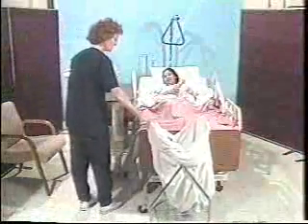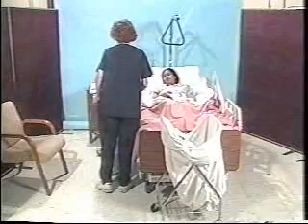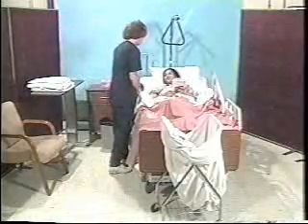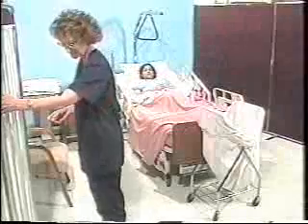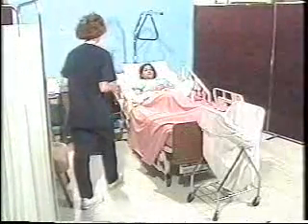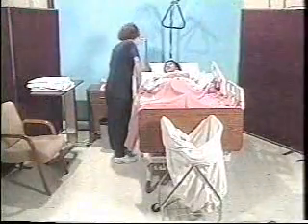As with all procedures, the caregiver starts by washing her hands. Then she collects the necessary linens. After placing the linen on a clean surface, she explains the procedure to the patient. She provides for privacy by pulling the screen around her patient and raises the bed to a comfortable working height for using proper body mechanics. Next, the caregiver lowers the head of the bed as near to flat as is possible.